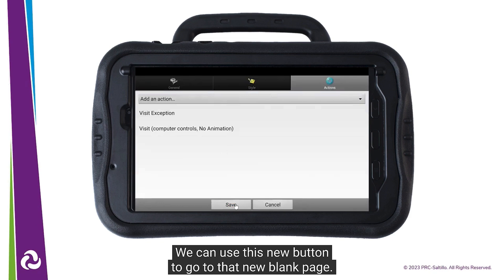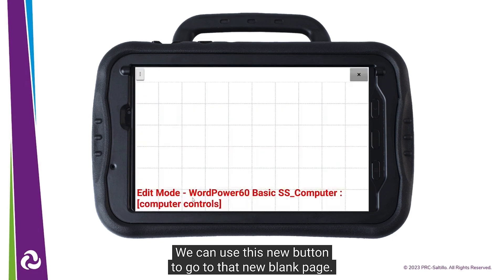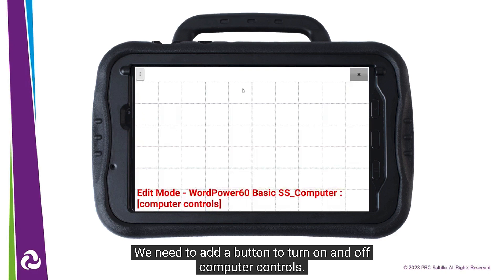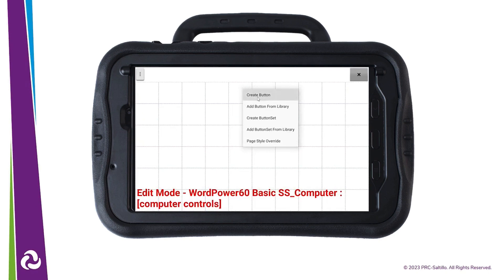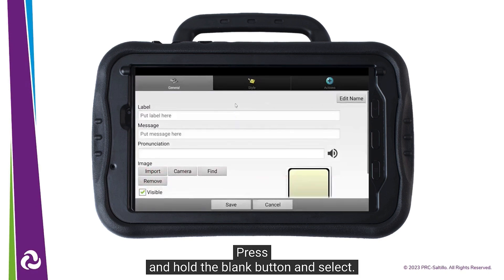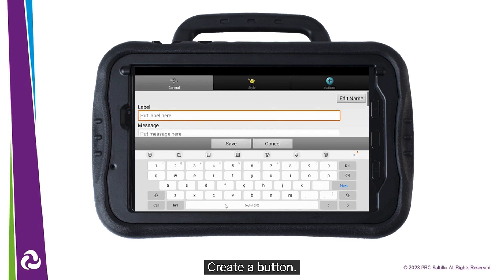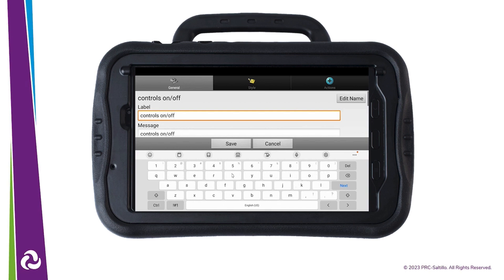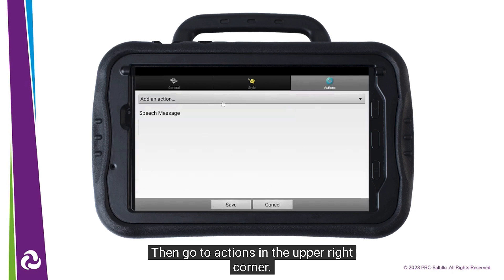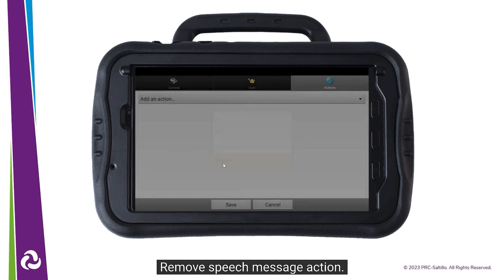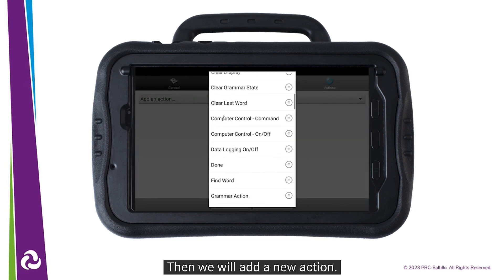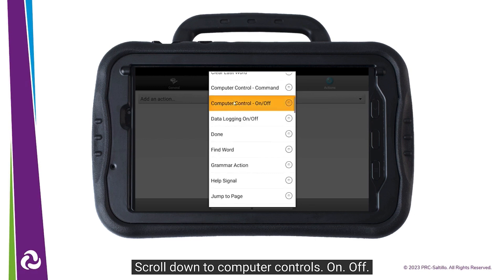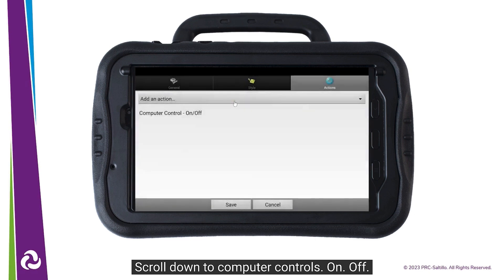We can use this new button to go to that new blank page. We need to add a button to turn on and off computer controls. Press and hold the blank button and select Create Button. Give the button a name — let's call this Controls On Off. Then go to Actions in the upper right corner. Remove the Speech Message action, then we will add a new action. Scroll down to Computer Controls On Off. Select Save.